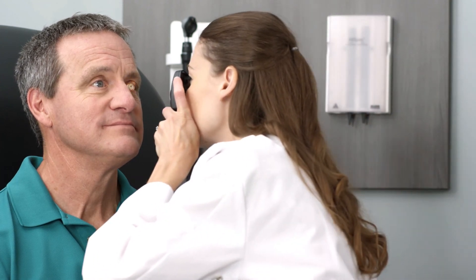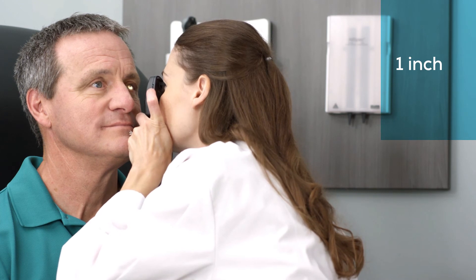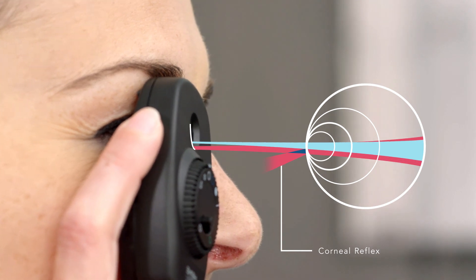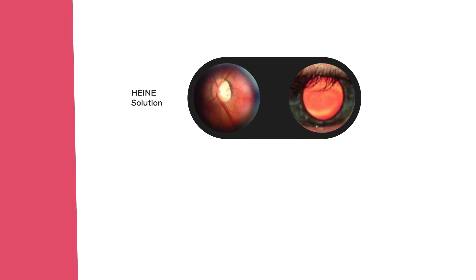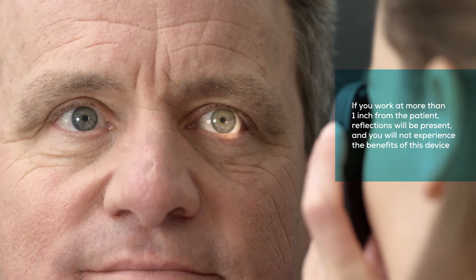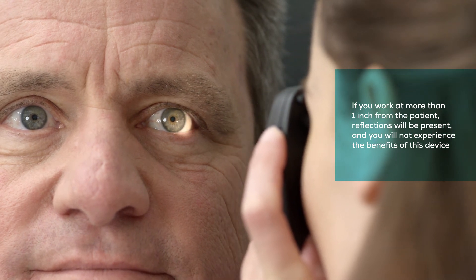First, while staying focused on the red reflex, move in until you are approximately one inch from the patient's eye. This is a closer distance than with a traditional scope, but at this distance, the exclusive aspherical optical system works properly, redirecting the corneal reflections down and away from the path of sight. This exclusive optical system provides clear, unobstructed views of the retina by eliminating distracting reflections from your field of view — unlike other systems that reduce resolution and contrast. If you work at a distance further away than one inch from the patient's eye, reflections will be present and you will not experience the benefits of this device.